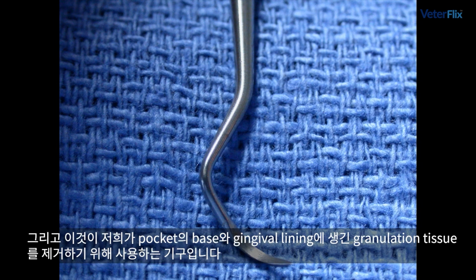And so this is the instrument that we're going to use to clean out that inflamed granulation tissue that is in that pocket at its base, and also attached to the lining of the gingiva in that pocket between the gingiva and the tooth root.